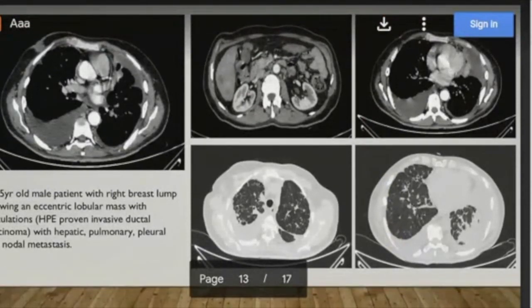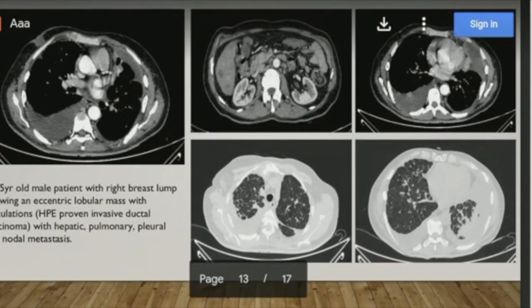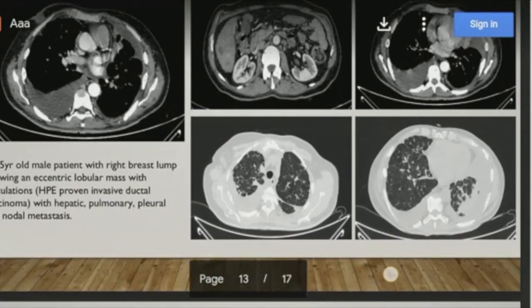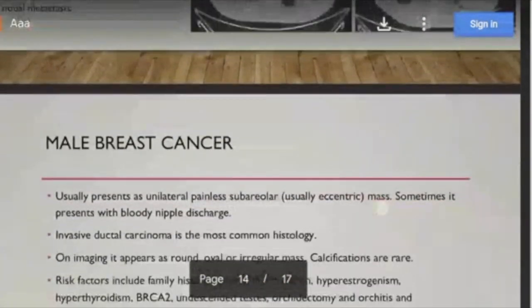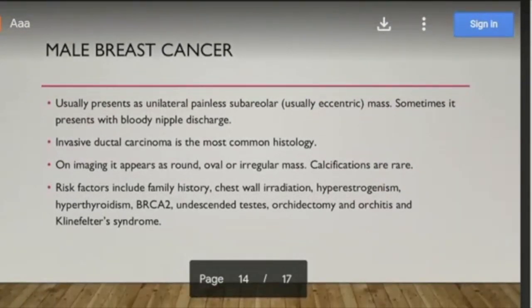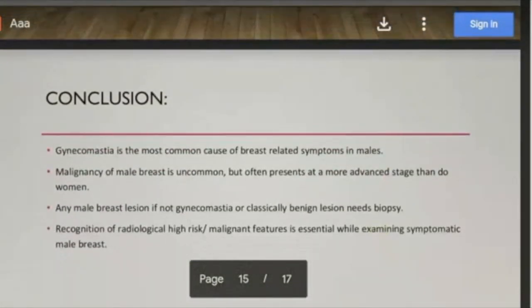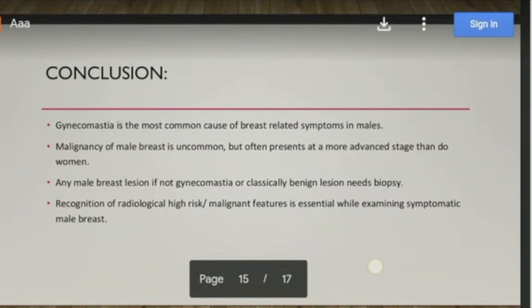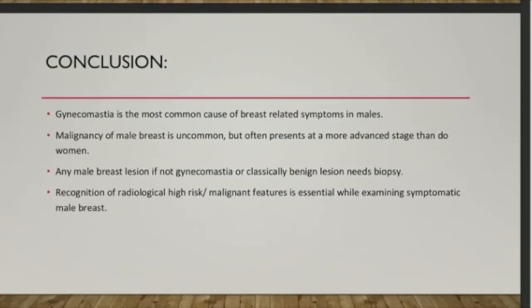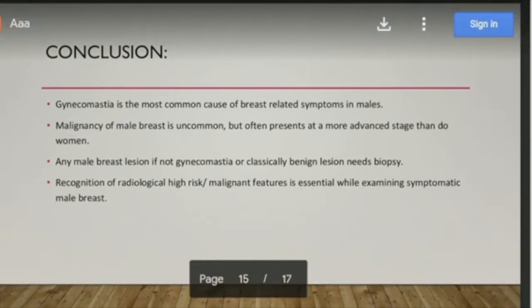One case example showed a mass in the right breast; on CT, the patient had hepatic, pulmonary, pleural, and widespread metastases even though the original mass was very small. High-risk patients include those with positive family history, chest wall irradiation, hyperestrogenism, BRCA mutation, undescended testis, or orchidectomy. Any suspicious lesion in a high-risk patient, with or without high-risk radiological features, should be evaluated very carefully and biopsy should be performed if needed.